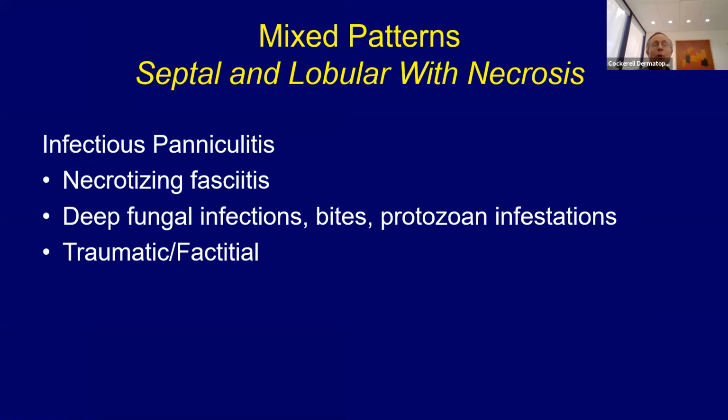So the last few examples will show some mixed patterns, septal and lobular. So when you see this, you sort of think of things that don't fit the classic manifestations, things like trauma, factitial, infectious panniculitis, deep fungal, sometimes bites.